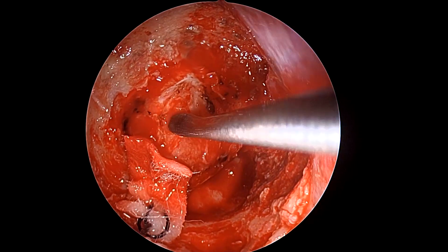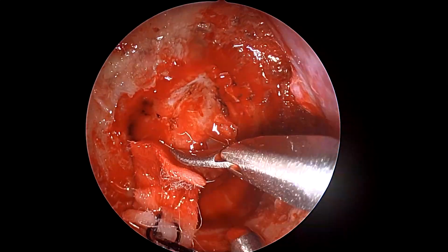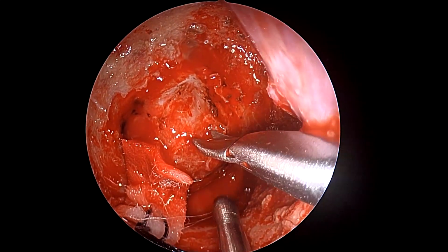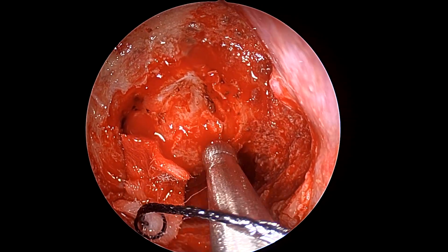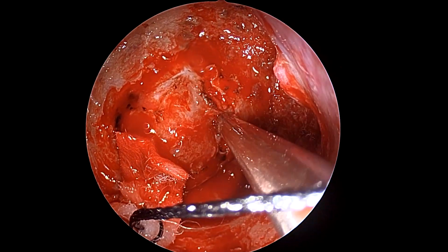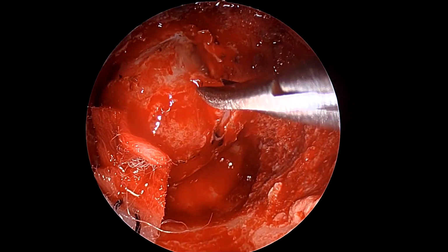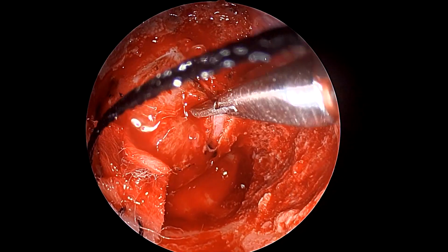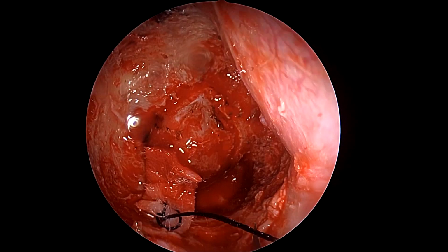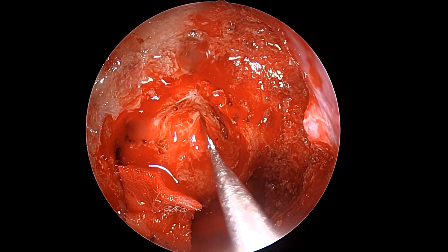Now, as we have given the incision, we're using a blunt elevator to palpate. As you see, the tumor is slightly fibrosed. It's not something that just starts flowing out of the incision as one would have it in a primary case. So yes, it's a fibrous tumor. We understand that it's post radiation therapy, though there's thankfully no history of taking any drugs like bromocriptine, because then that would become an additional risk factor in terms of its overall adhesiveness to the surrounding dura and the internal carotid vessel. Once again, using the Doppler to mark the locations of the carotids on both sides.